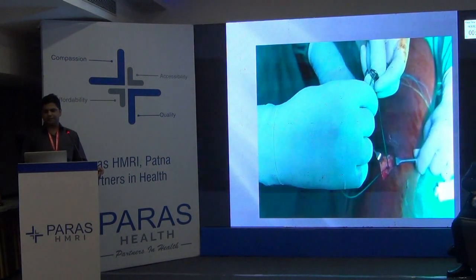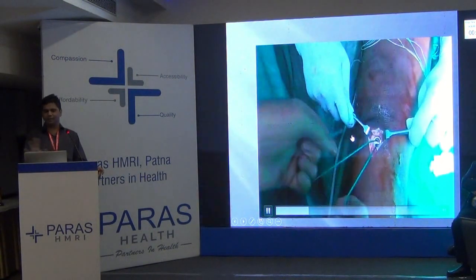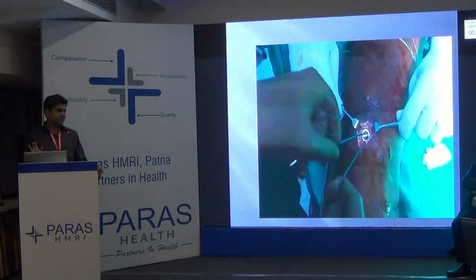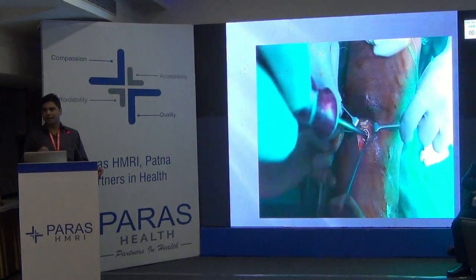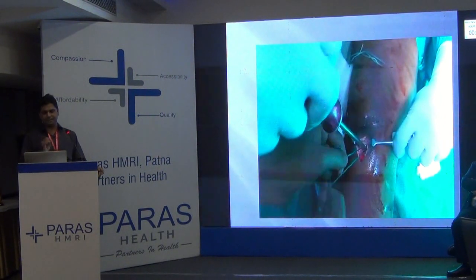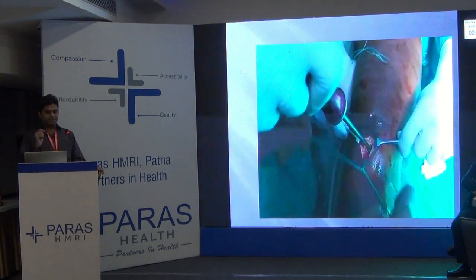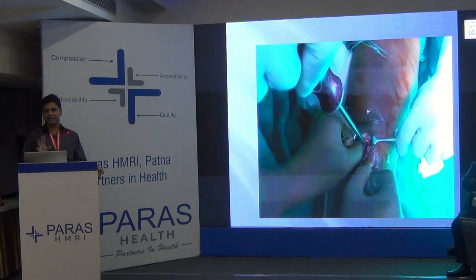This is a simple suture disc. This particular make is Smith and Nephew, but every company is making suture discs. You have to be very sure that the edges are not sharp, else they will cut your ethibond. If you are not very sure about your edges, then you have to take fiber wire for the preparation. So your assistant is pushing the suture disc with a screwdriver or any other blunt instrument.